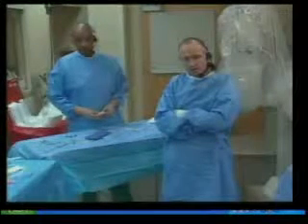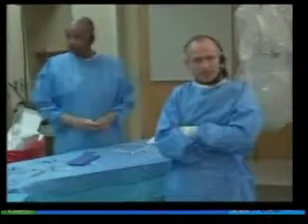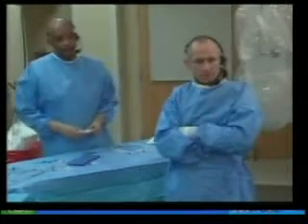So I think that's one of the things that we've learned since the original days of distal occlusion with the PercuSurge device, that patients can actually be trained. Right. And I think the other thing we've learned is that you can't predict, as much as you try to predict what's going to happen, you never know until you inflate the balloon.